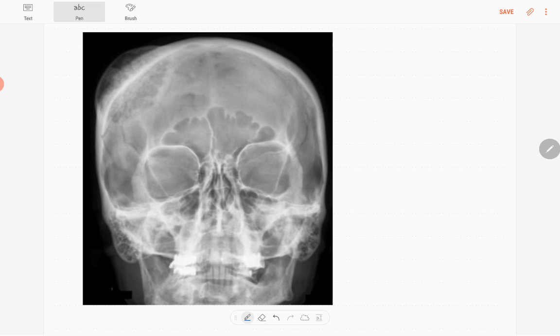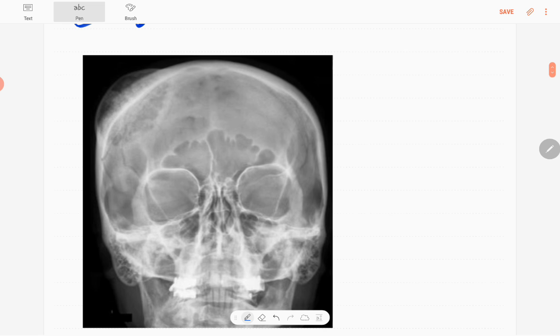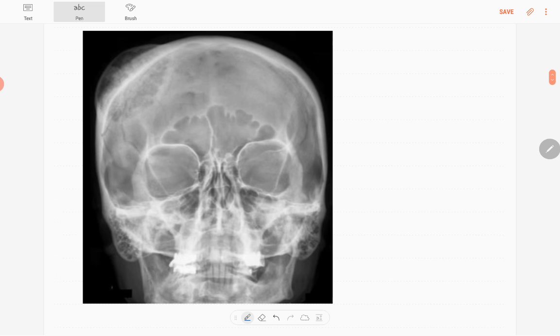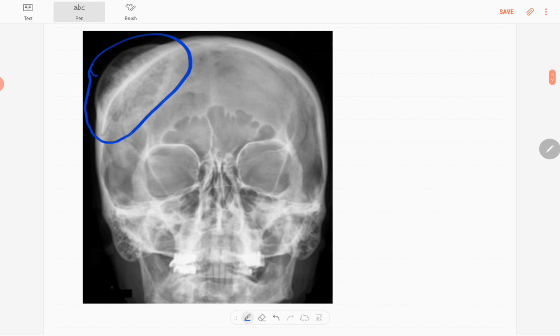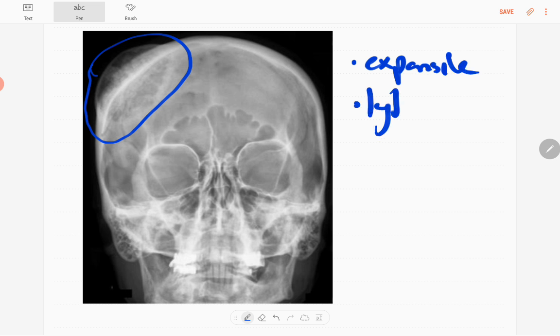You can see the abnormality, it's in the right frontal bone. There's an expansile lytic lesion. It's actually a well-defined one with some sclerotic margins.